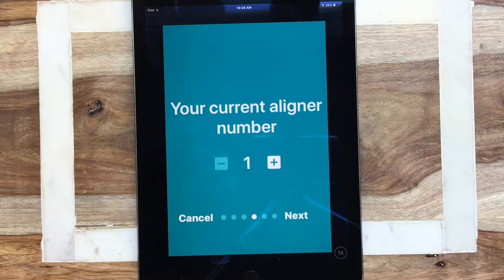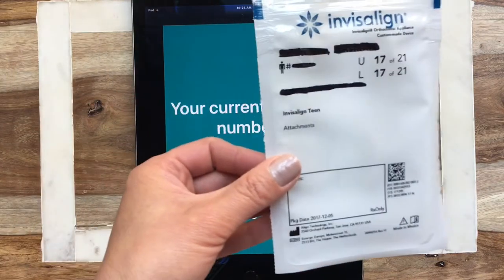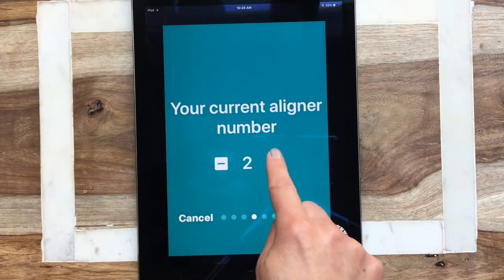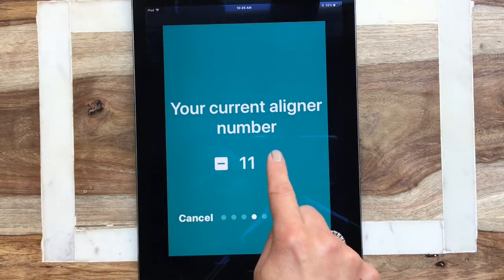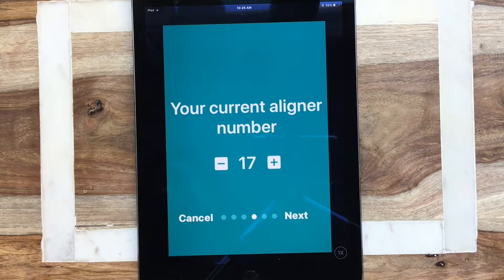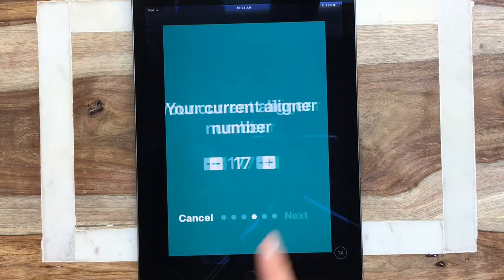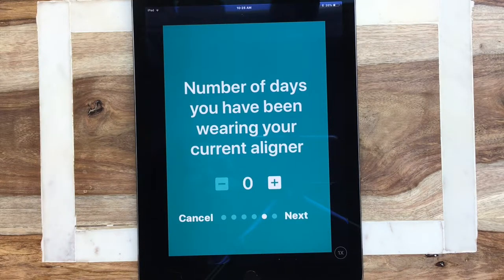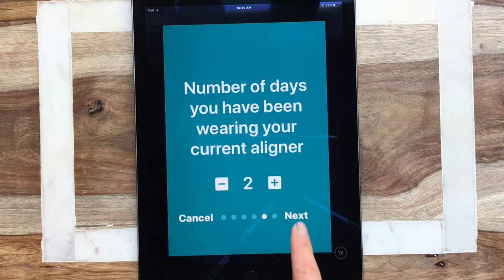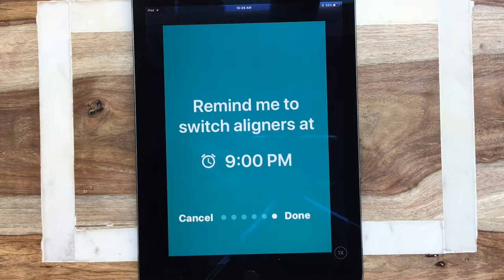Your current aligner number — for this patient it's at 17. If you are starting fresh and haven't started your treatment yet, then you will be at one. Hit next. Number of days you've been wearing your current aligner — let's say you've been on aligner number 17 for about two days, so just hit two and go next.